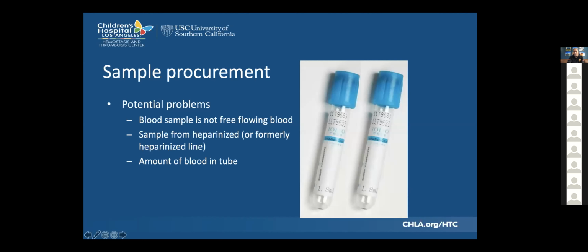Here we focus in on the tubes a little bit more. What you'll notice is that these tubes, unlike most other blood tubes, have a line. There's this little blue line right there, and that's the fill line. You do need to fill the blood right up to that line. You don't want to overfill, you don't want to underfill. It doesn't have to be 100% exact, but it can't be 10, 20% below, and you don't want it overfilled either. A proper coagulation lab, if they get a tube that's underfilled, typically it's more underfilling, right? You don't get enough blood. They should reject it because you're going to get false results, which is not helpful to you. So don't get upset with the lab if they reject a sample because it wasn't filled properly.